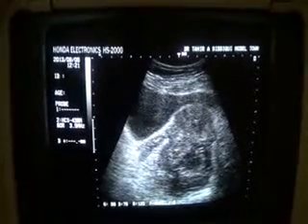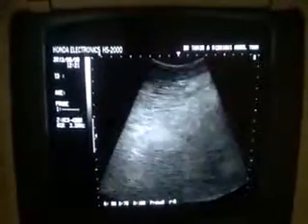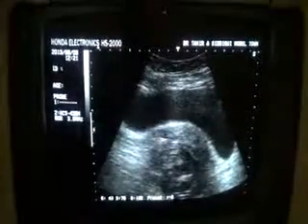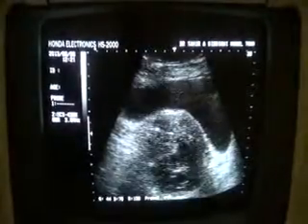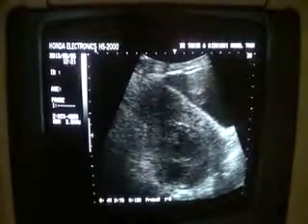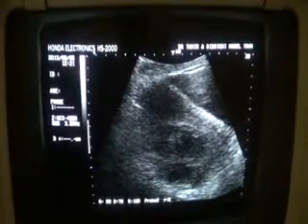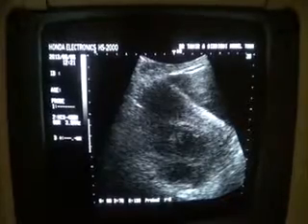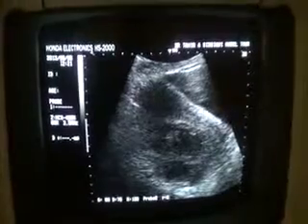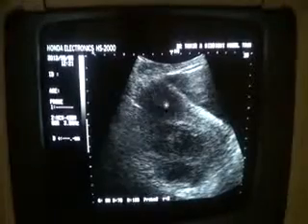This is the uterus, this is the endometrial canal, and in longitudinal section we do see that the uterus is being elevated. You can see the cervical canal. This is the cervix. The cervix is straight because of this fluid-filled cavity posterior to it. It's elevating the cervix. This is the cervical canal. This is the endometrial canal.